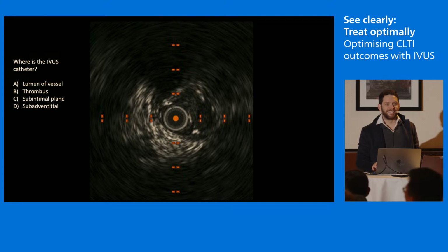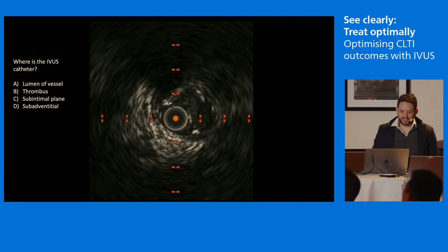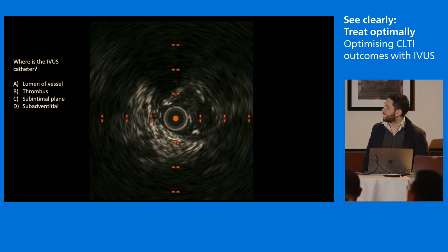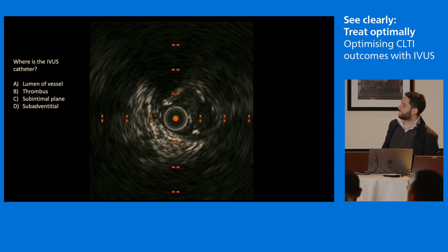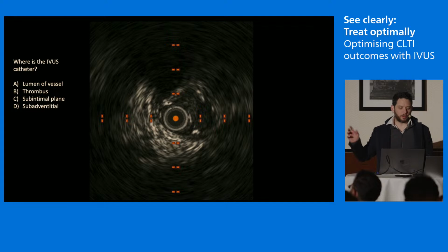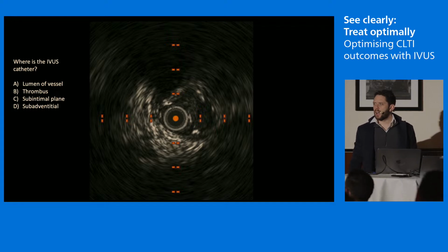JJ, you might. Okay, where is the IVUS catheter? Could we just turn off those lights? Is that possible? Might be easier to see. Yeah. So hands up for luminal. Hands up for subintimal.